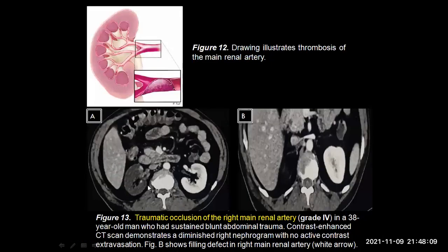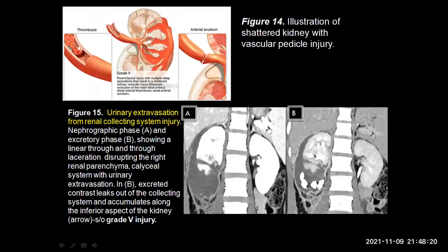Again, one more case of grade 4 injury where you can see that there is thrombotic occlusion of the right renal artery and there is global infarction of the right kidney — this is also graded as a grade 4 injury. Coming to grade 5 injury, this includes either a shattered kidney or a vascular pedicle avulsion at the renal hilum. Here you can see that in the right kidney there is a through-and-through laceration in the lower pole region extending into the collecting system. This can be very well demonstrated in the delayed scan where in the excretory phase you can see that there is active contrast extravasation. Such contrast extravasation and collecting system injury will comprise only a grade 4 or a grade 5 injury.